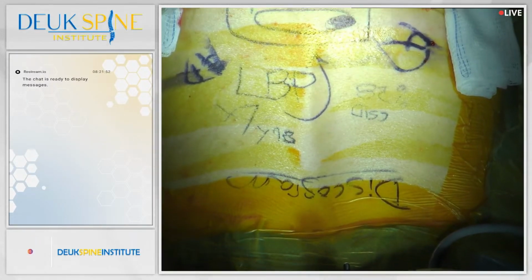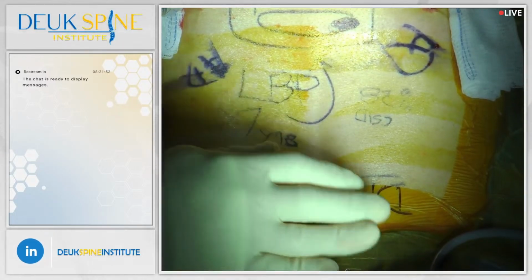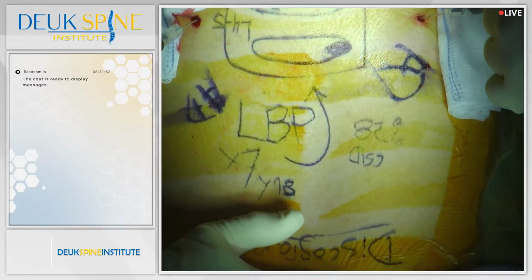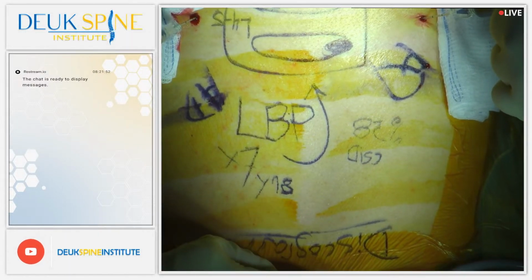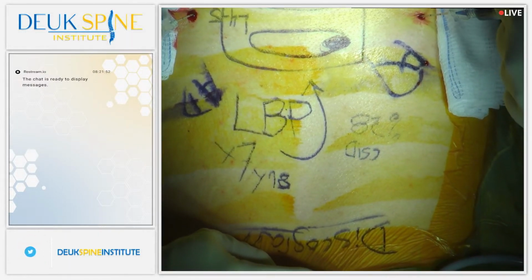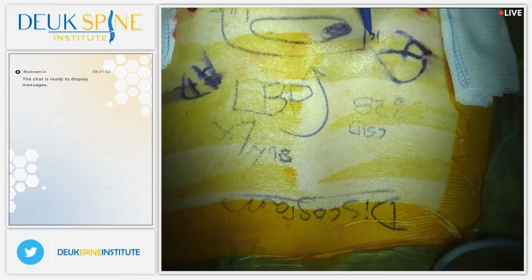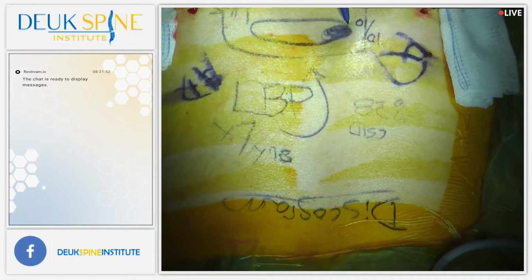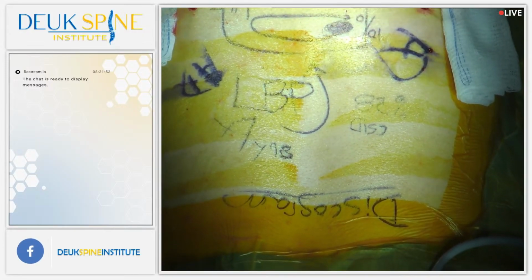He said he's good. Are you having any pain right now? Are you comfortable? How bad is that on a scale of 1 to 10, 10 being the worst pain? Give us a number. 10. Is that where you get back pain? All right, he had 10 out of 10 pain. It was horrible. He tensed up. It's concordant, meaning that's where he typically gets it.